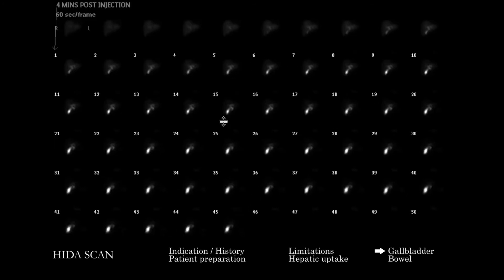It's important to know that you have to be able to see bowel activity before giving any morphine. If there's delayed gallbladder uptake — so not in this case where we're seeing it early — but if you go past an hour and then actually see the gallbladder after an hour, that could correlate with chronic cholecystitis. You want to be looking at prior studies and even consider a gallbladder ejection fraction study.